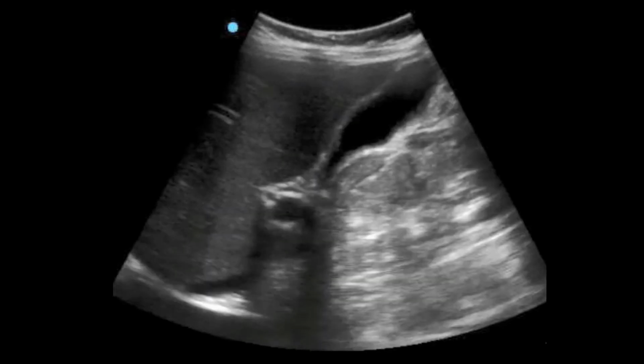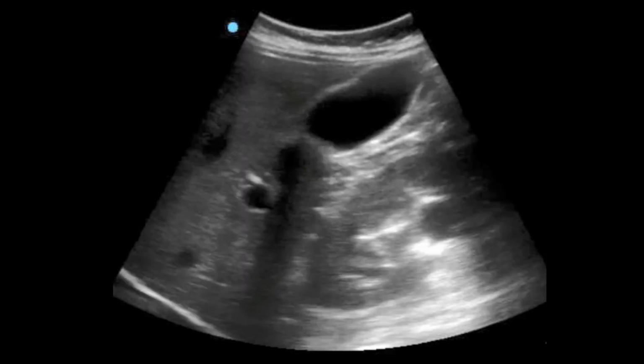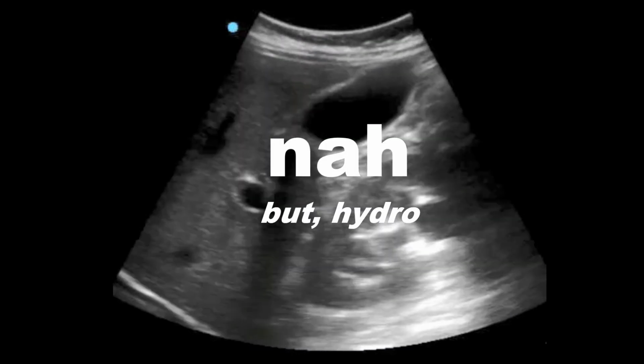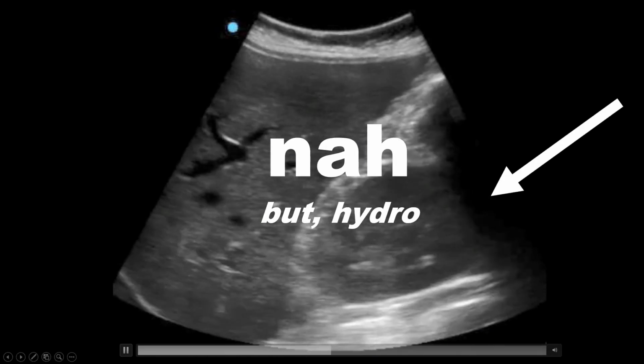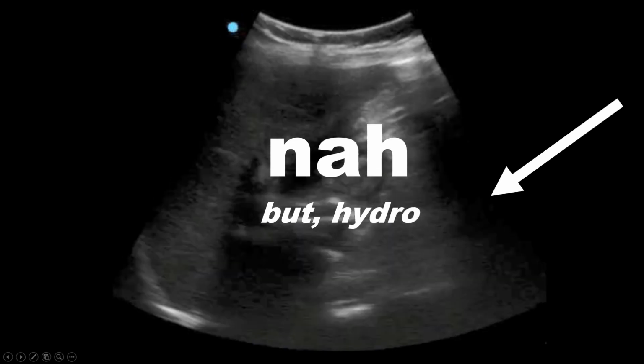Here's another example. Do you see any evidence of gallstones? Yeah, I don't either. But did you actually catch this finding? There's actually hydronephrosis here. Really pay attention to everything going on in the right upper quadrant.